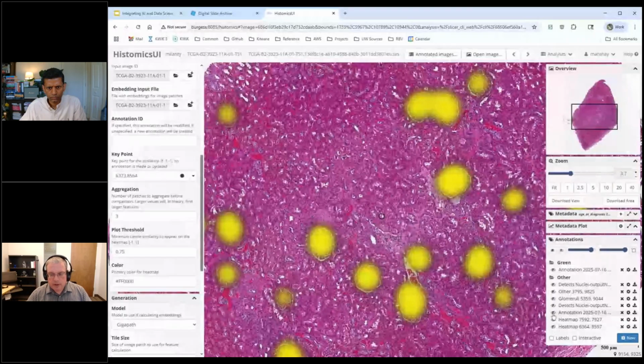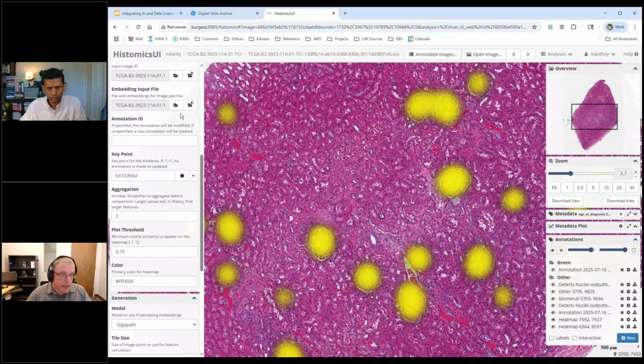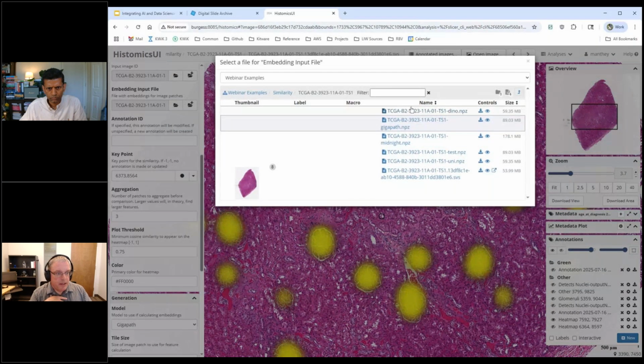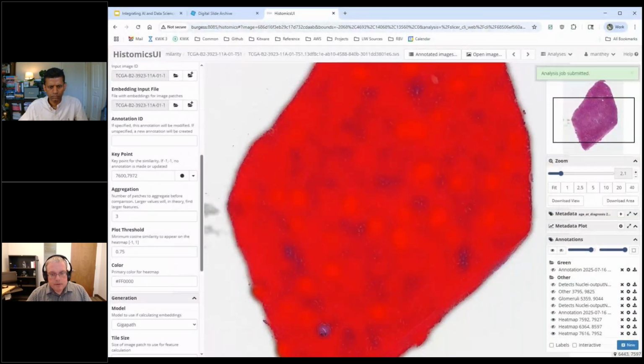So we'll leave our glomeruli up here, and we'll show off picking another foundational model. And so, still there, we pick a... so Dino is not a pathology foundational model. It is just a model that has been trained on images in general. And it's sometimes a base for these other models. And if I click on a glomerulus and give it a moment, everything looks similar, except maybe that spot. I mean, it found tissue versus slide, but this is not a useful result.